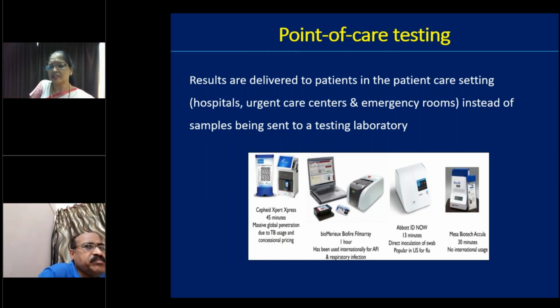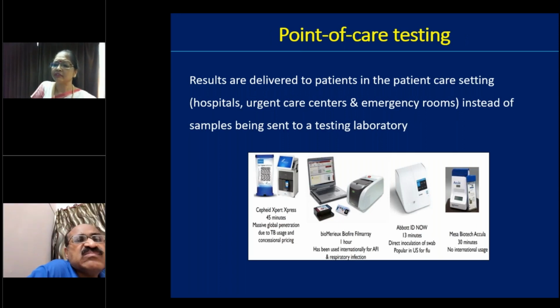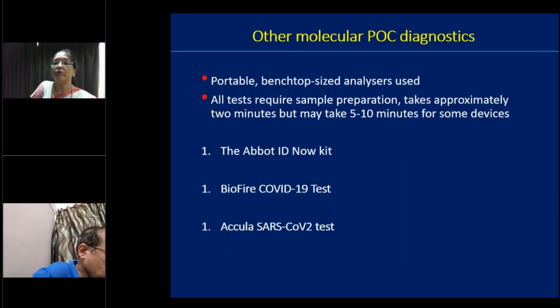But the problem with this, which can be done in a very short time, like sample preparation time 5 to 10 minutes, then 10 to 15 minutes for reporting, is that all of them are very low throughput. So when you have to do very few tests, these are useful. But in a large setting like ours, neither are they cost effective nor very useful, in a country like India.